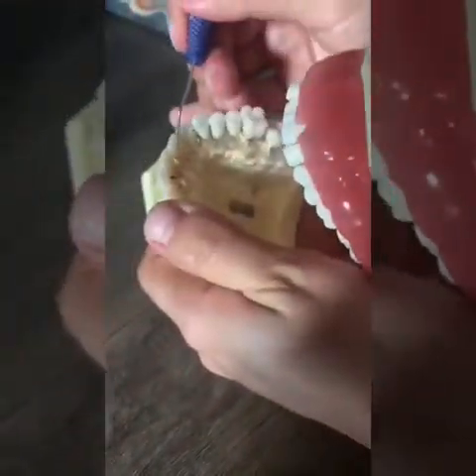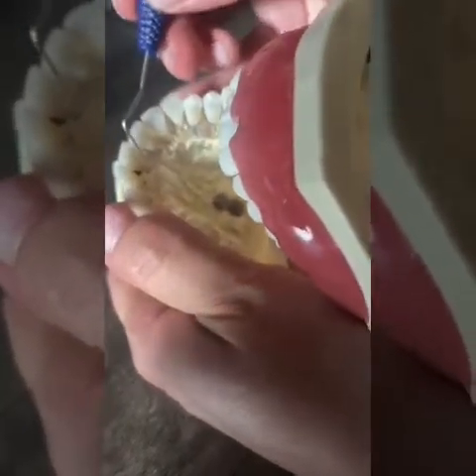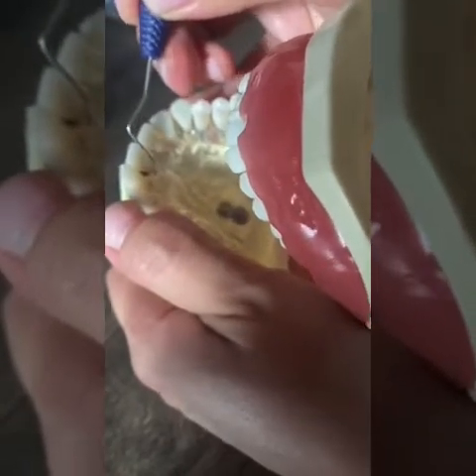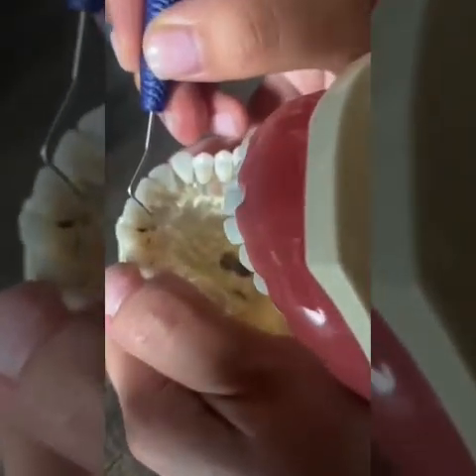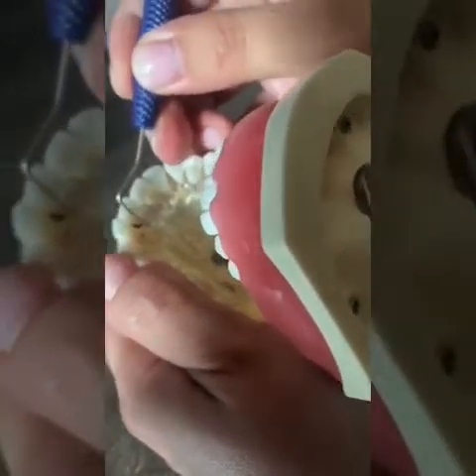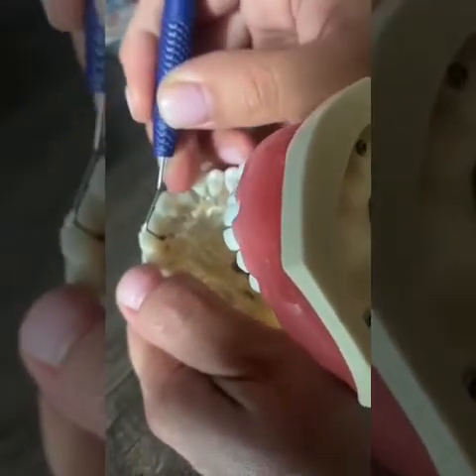Now we're going to go on the inside and say we're on tooth number 8 again. So we're going to put the instrument at the mesial line angle, okay? We're going to walk, mesially, tilt the instrument 10 degrees into the interproximal area and record. Take out instrument, mesial line angle, walk, distal line angle, record. Distal line angle, walk, interproximal area, tilt instrument 10 degrees and record.